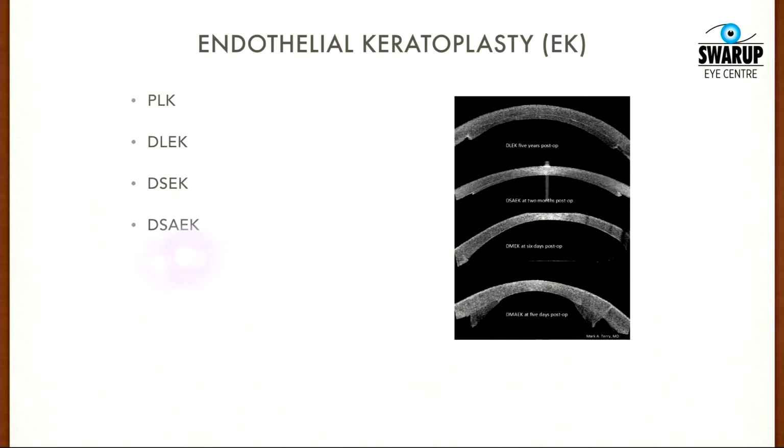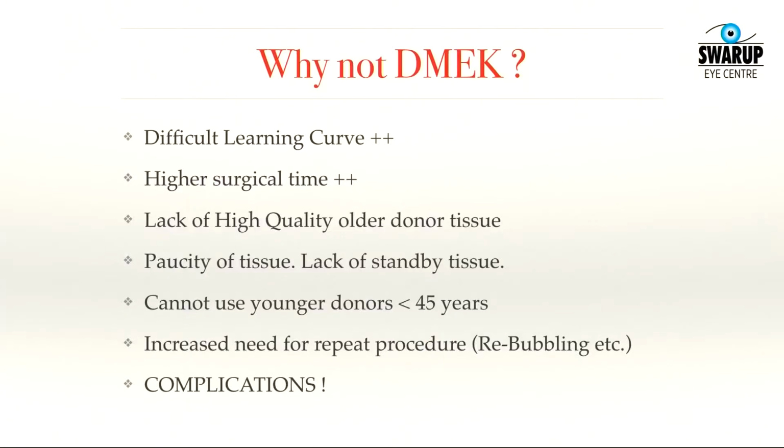So endothelial keratoplasty has been evolving. It's gone through PLK, DLEK, DSEK, DSAEK, DMEK and PDEK are now what people are doing. We'll be talking about DMEK in this particular course. So what are the reasons why one shouldn't be doing DMEK?